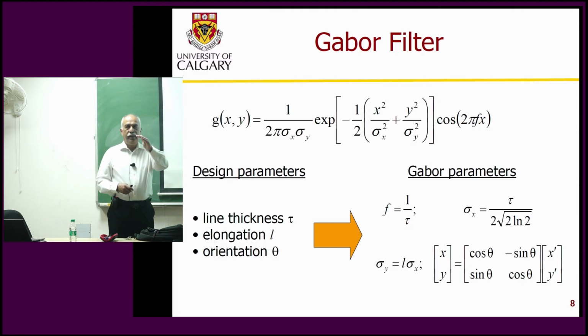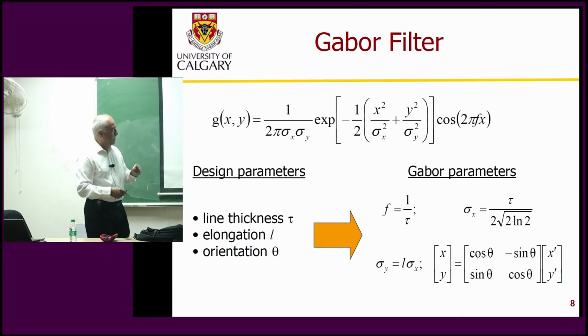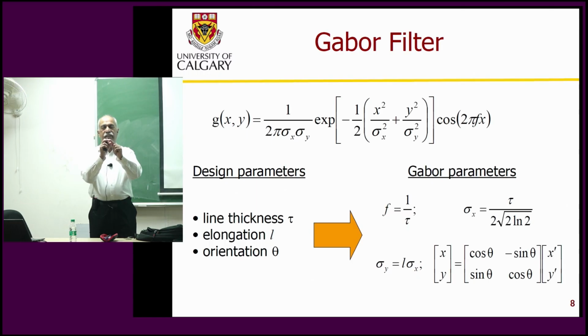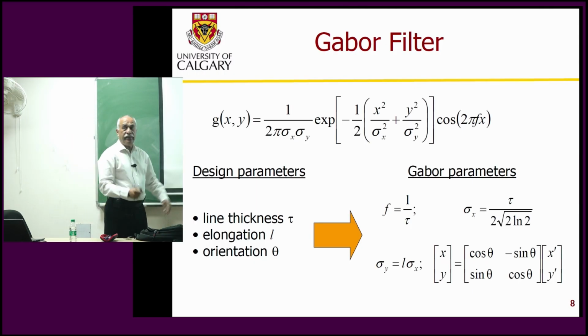These are fibroglandular tissues that may go in a certain direction for a small extent of space, and then curve and change direction slowly. So there is a certain thickness of these patterns. How many millimeters? Elongation: how long does it go in a certain direction before the direction changes? Is it just straight forever? Most likely not. For a certain distance there will be a certain orientation, and then it changes. Orientation theta at every pixel.